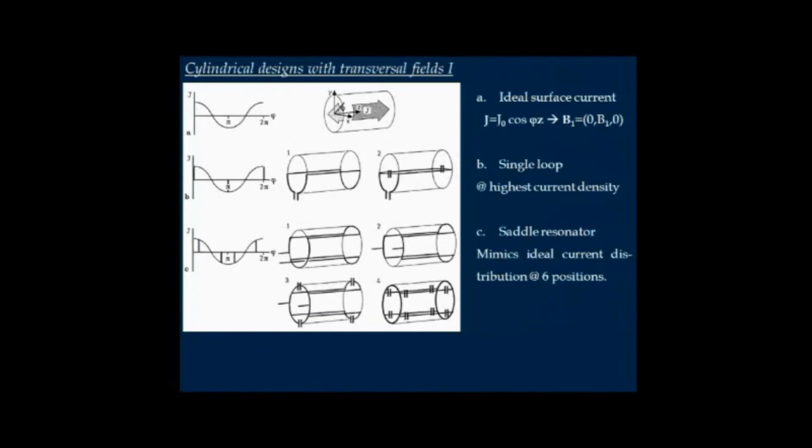An improvement of that, to reduce the complete cable length, again to prevent standing wave effects, you can break those on both ends by a capacitance. This has the other advantage as well, that it symmetrizes the electric fields within, and you reduce your electric losses.